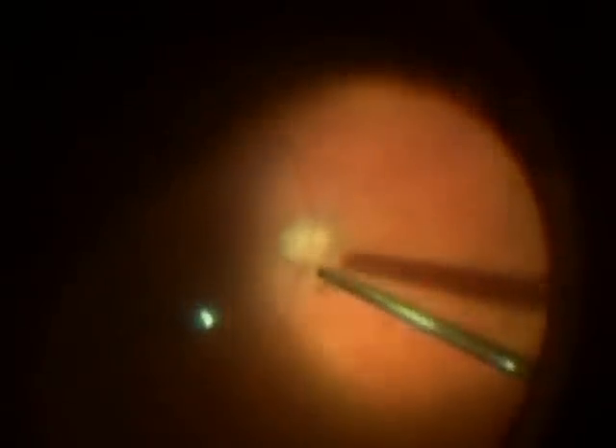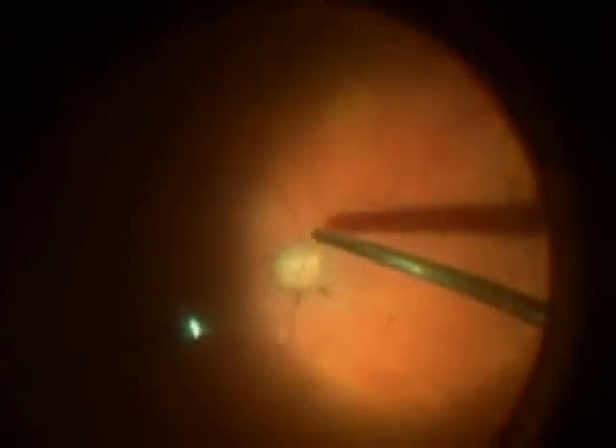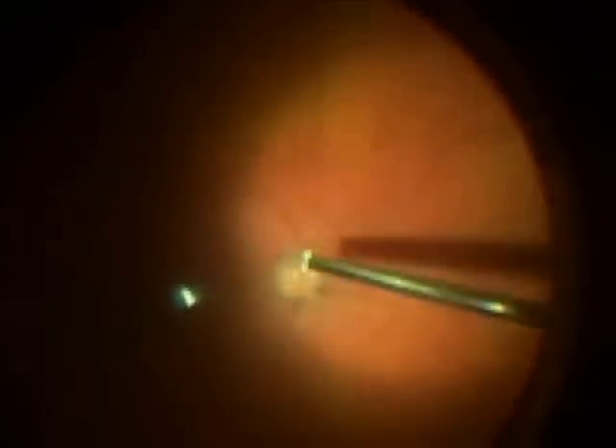Here you see the vitreous being pulled further. In the back of the eye is the key maneuver of macular hole surgery. It's very difficult to see the membrane. Here you see me pulling at it with the vitrectomy probe and elevating it away from the eye. You can see a little bit of the membrane in the light and also as it pulls free of the retina.